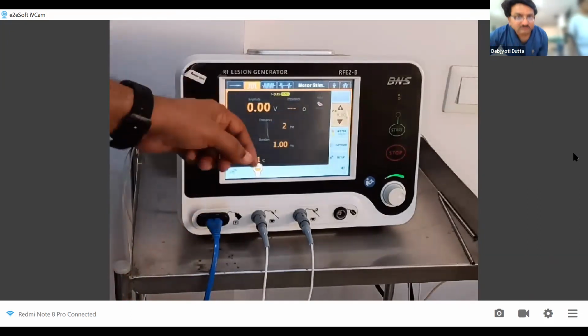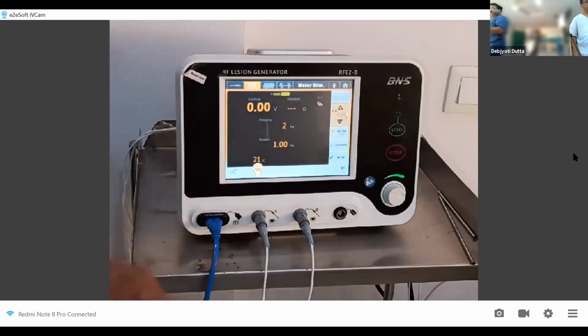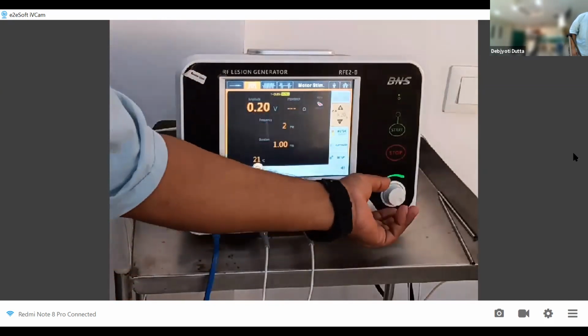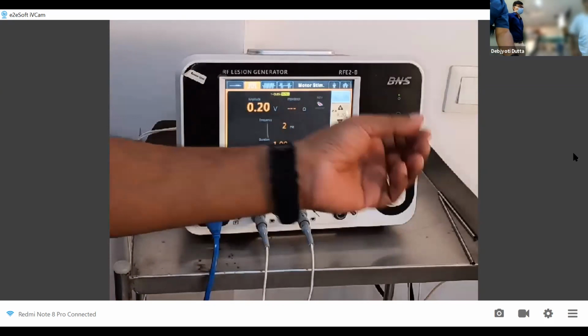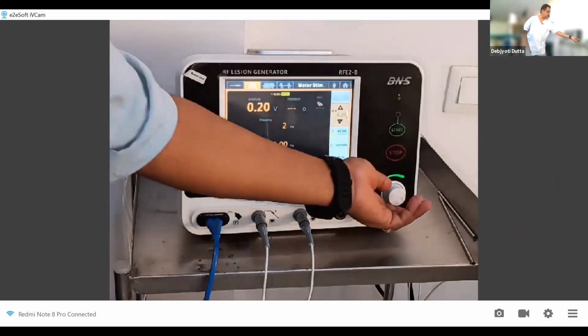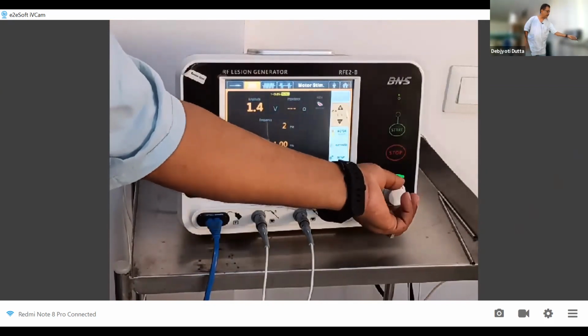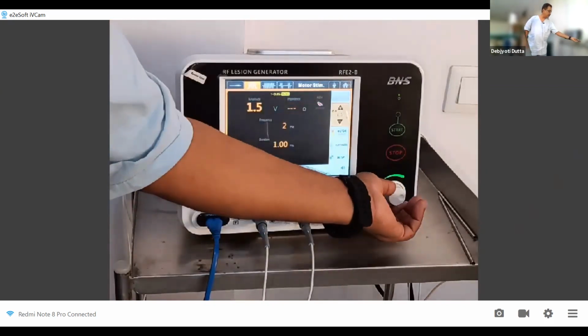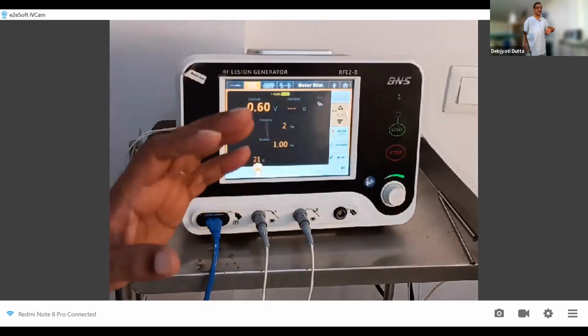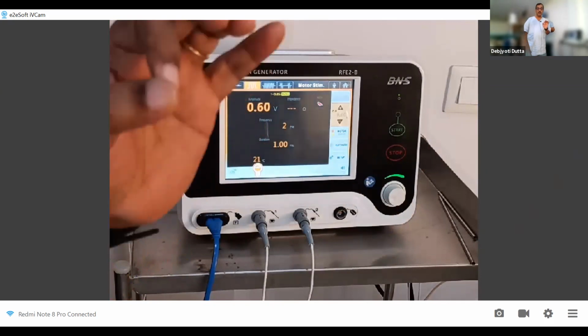And then this one is your stimulation. What you can do here is 2 hertz. I told you 1 to 2 hertz is for the motor stimulation, and by increasing this knob we can increase the voltage, and we can see how much is needed. Smaller voltage means we are very close to our nerve, and that gives the better result. If you are increasing too much and then getting the stimulation, it doesn't have any value. Ideally it should be less than 0.6 volts. If you are getting the stimulation at 0.6 volts, it means you are very close to the nerve.